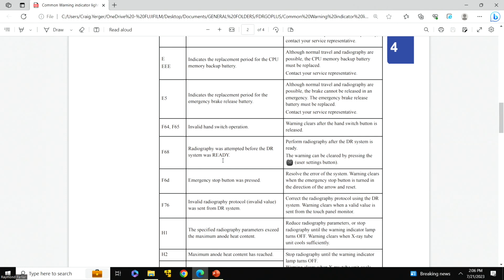In that instance, they're just pressing the exposure switch right to the bottom. They're not doing a prep and then expose. And from an app side, I do want to make sure F76 is covered. F76 is an APR code is missing from the user utility menu. So if you look in the reserved mass entry, that reserved mass entry will be blank or some obscure number like 3,500 or something. In that instance, when that menu is loaded, you would get an F76 error code.